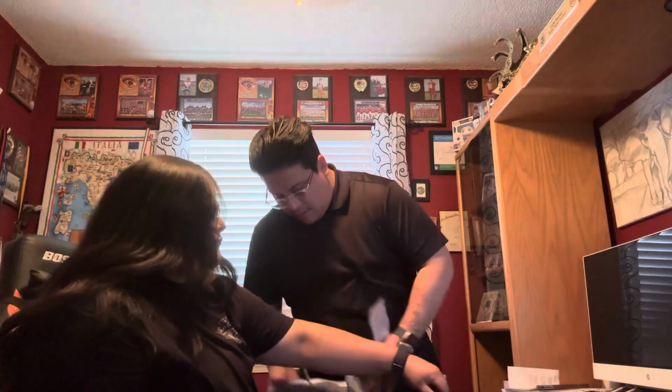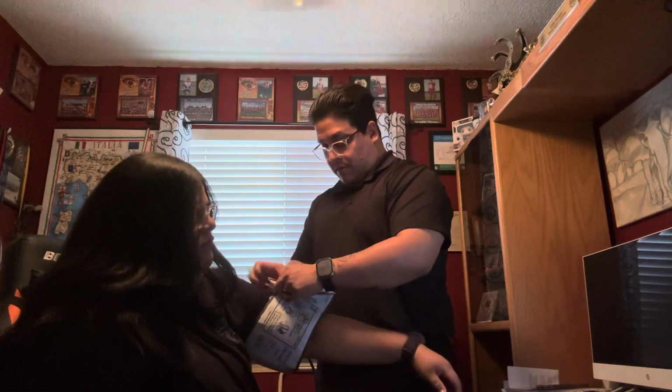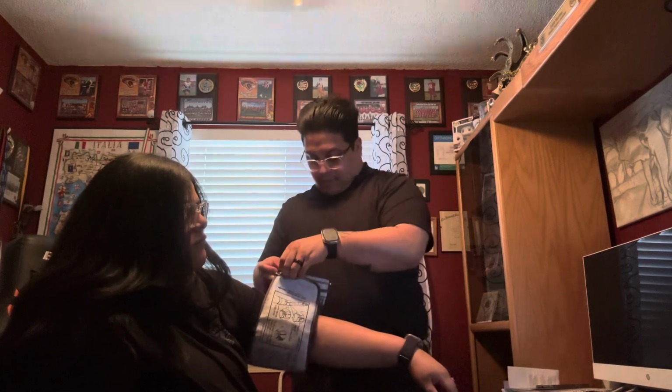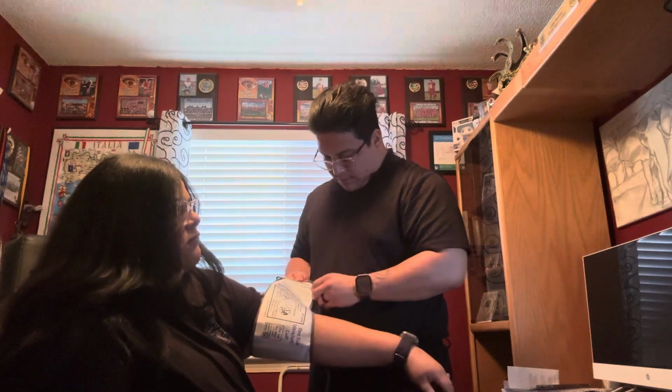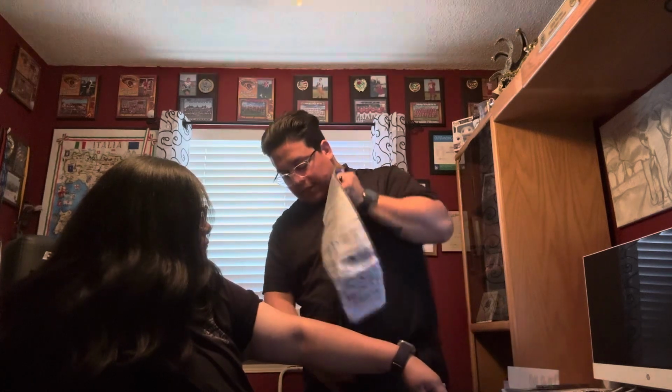So I'll get the blood pressure cuff out. Oh, this goes like this.